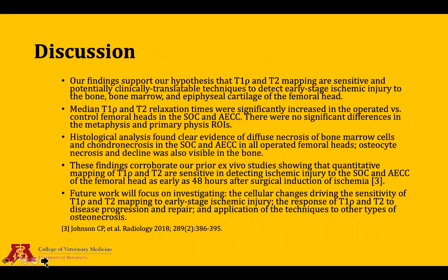Our findings support our hypothesis that T1ρ and T2 mapping are sensitive and potentially clinically translatable techniques to detect early-stage ischemic injury to the bone, bone marrow, and cartilage of the femoral head. Median T1ρ and T2 relaxation times were significantly increased in the operated femoral heads in the SOC and AECC when compared to the control femoral heads.